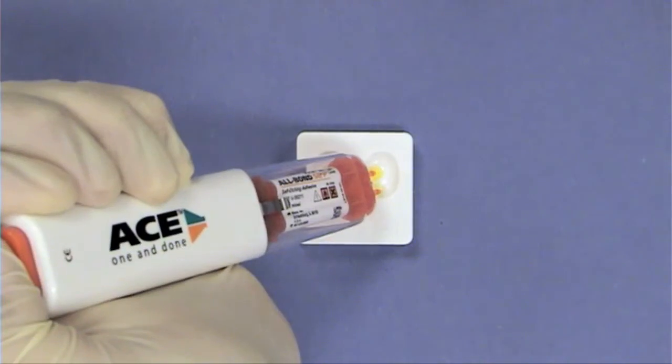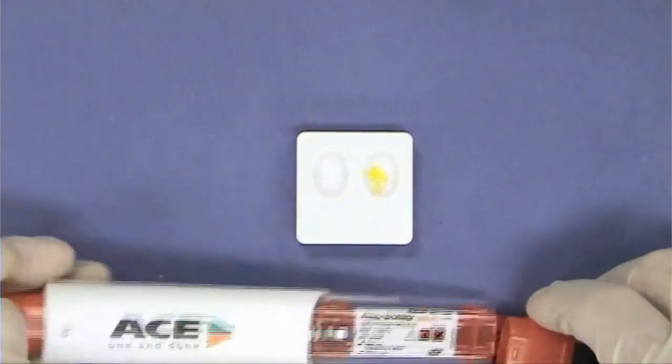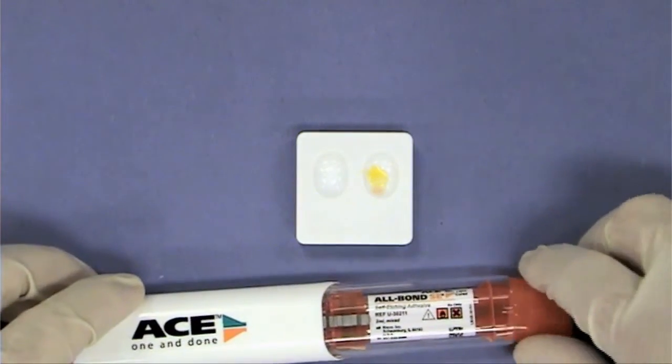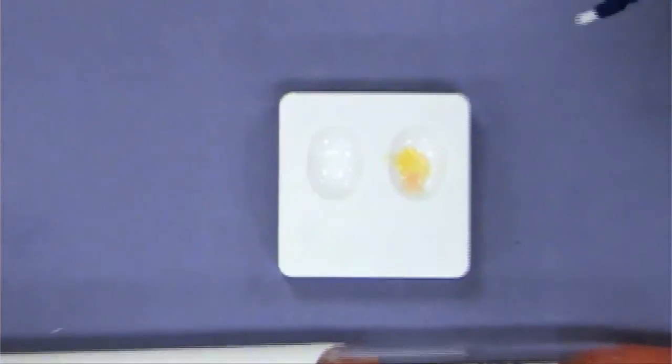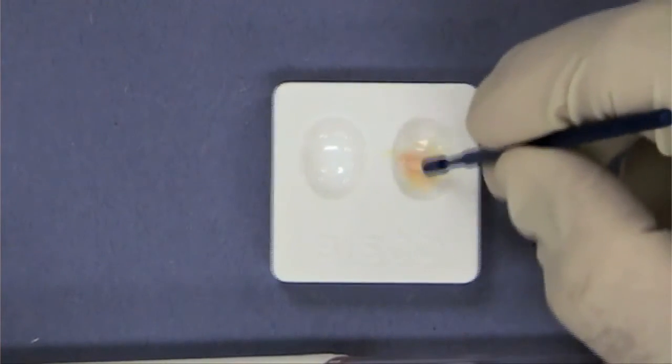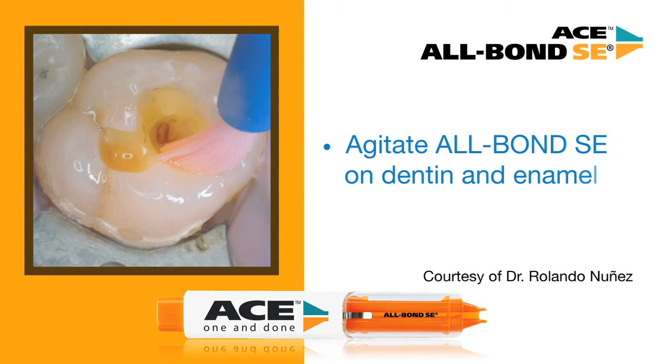Position both cartridge tips over the mixing well and press the orange button one time. The correct proportion of material is dispensed. Using a brush, mix Allbond SE until it is uniformly pink. Place Allbond SE on enamel and dentin, agitate and air dry, then light cure for 10 seconds.